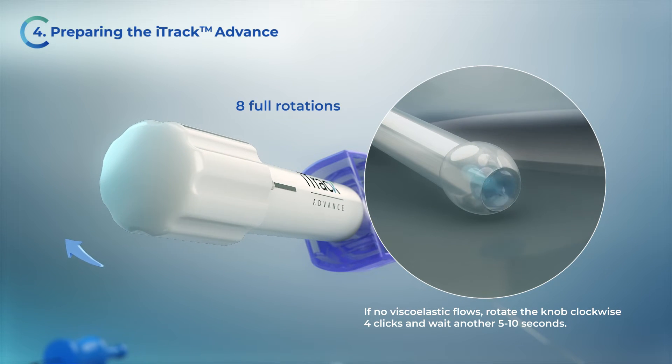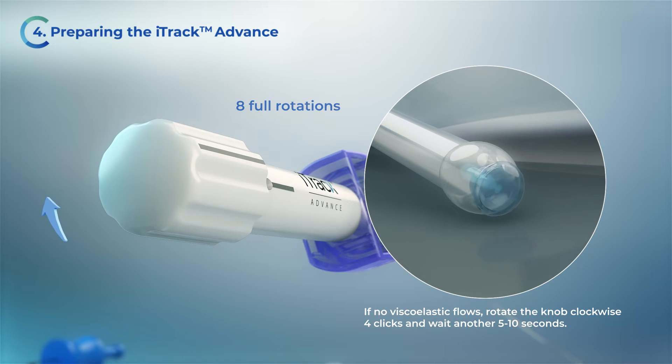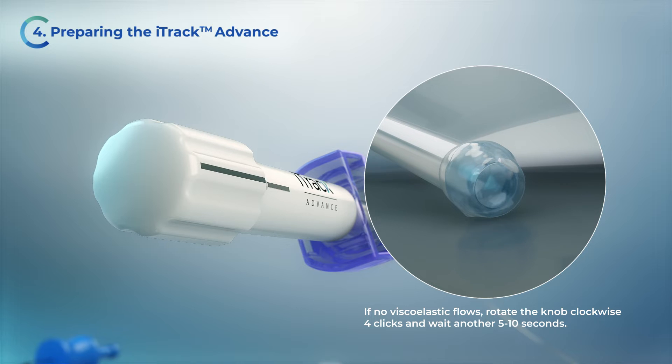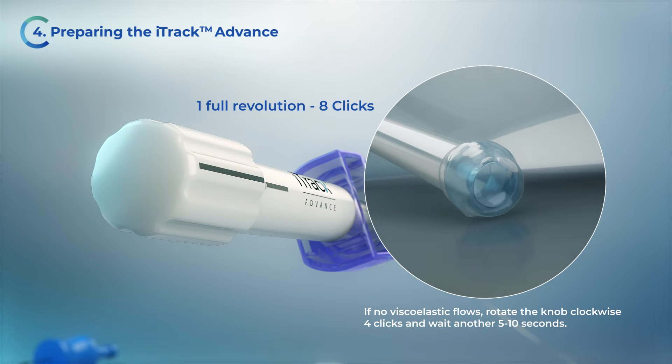Approximately eight full rotations of the knob will be required. When the black line on the knob aligns with the black line on the handle, this indicates one full revolution or eight clicks.